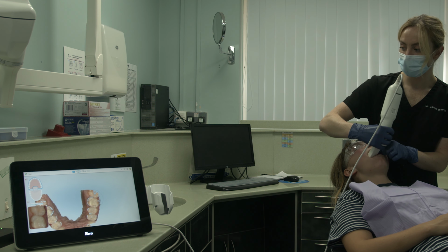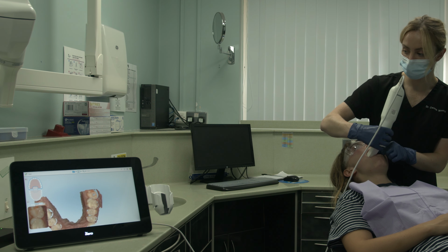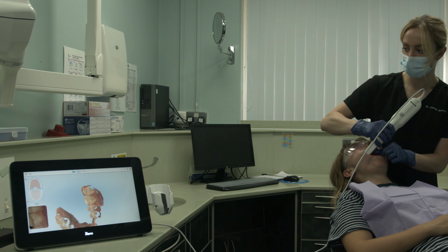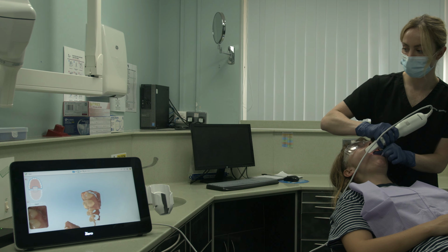Sometimes it can be difficult to get the wisdom teeth in at the back, so if you just ask the patient to move their jaw to the left, that gives you a little bit more space just to get around the back of that wisdom tooth.